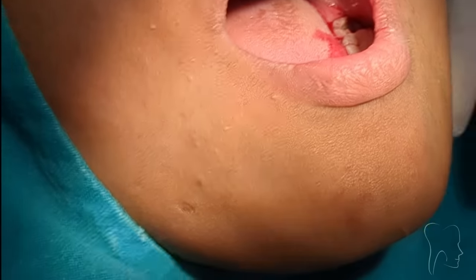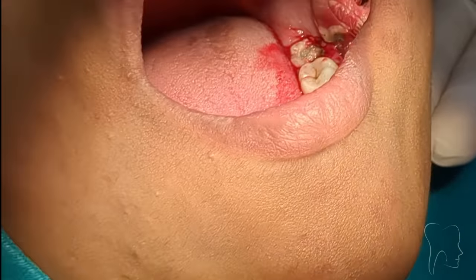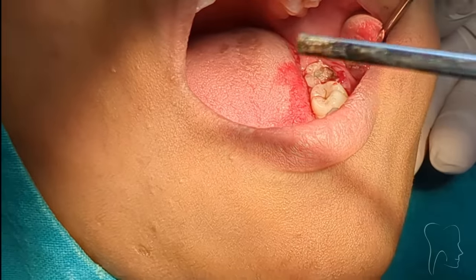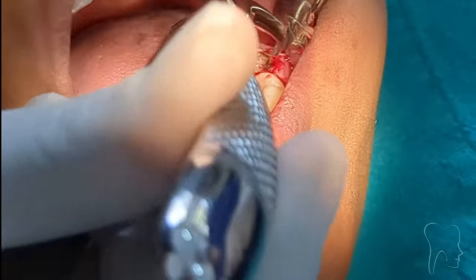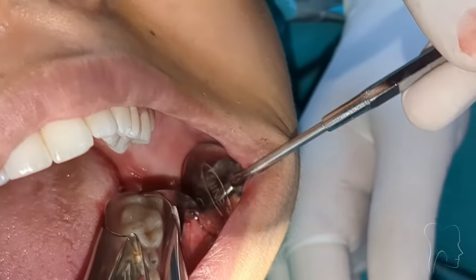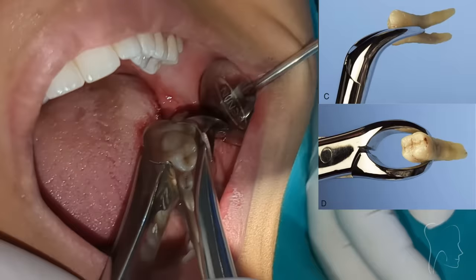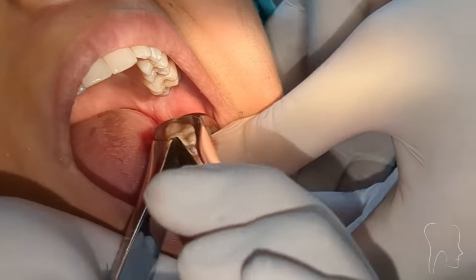If you are thinking I am doing both hands — I am ambidextrous, I can work with both hands. So I am holding the tooth at the CEJ between the two roots at the furcation area. Now I am going to support the mandible.